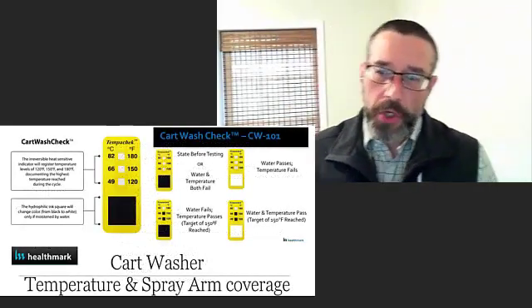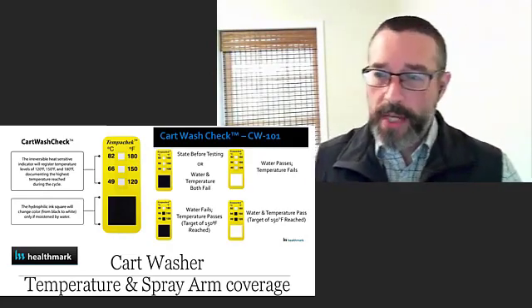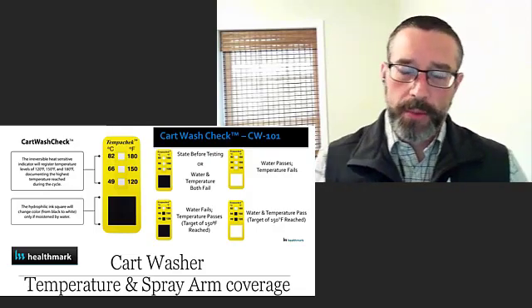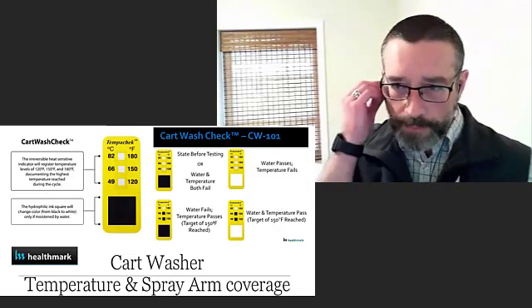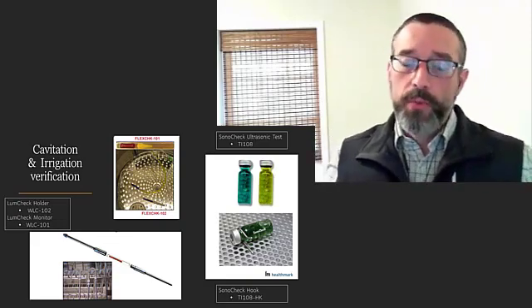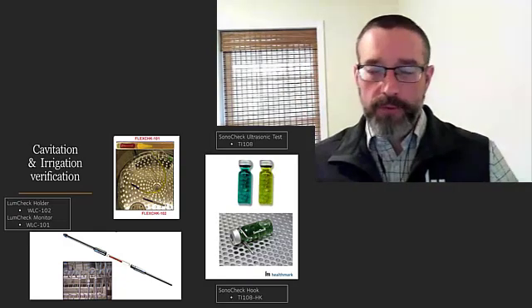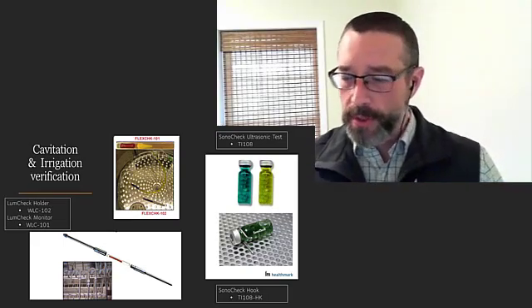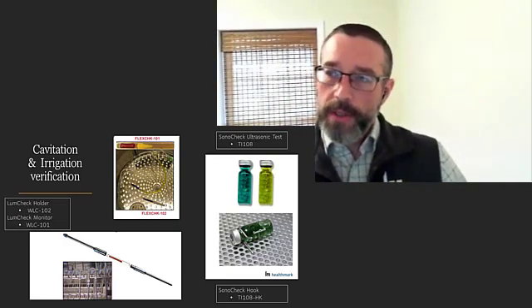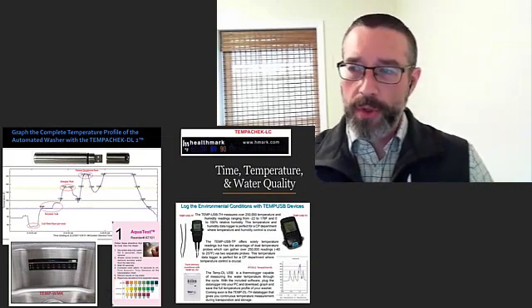If you're lucky enough to have a cart washer, then of course the cart washer needs to be checked. If it has an instrument cycle, then you're actually going to go back to that test soil surrogate device. If it does not, and you're just looking for spray arm coverage and temperature, there are simpler tests out there that are able to do those kind of tests. As I mentioned, anything that has irrigation, that irrigation is really there to help remove soil from internal lumens. So simulating a lumen and simulating test soil and verifying that flush function was able to help clean those devices is something that you need to test. And then, of course, tests for cavitation are out there that are going to let us really know that those transducers are working properly. Water is a big thing with temperature, and then of course disinfectants as well.